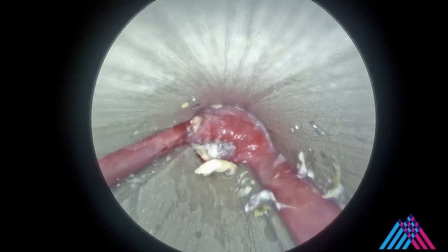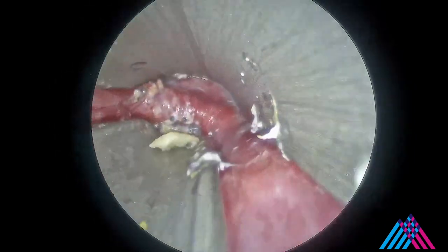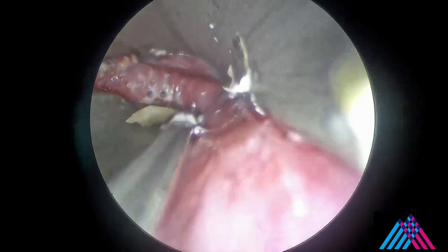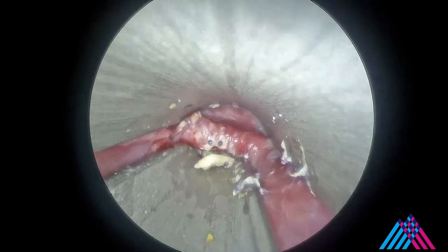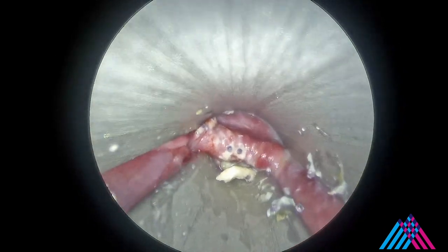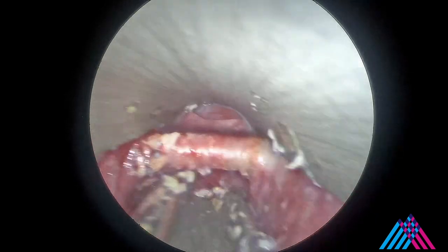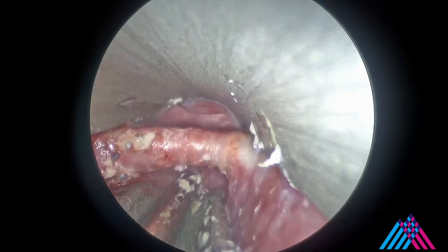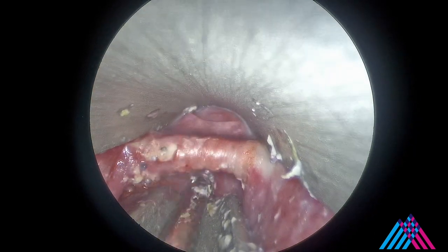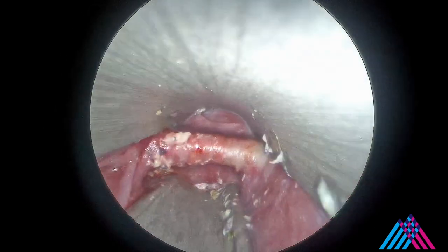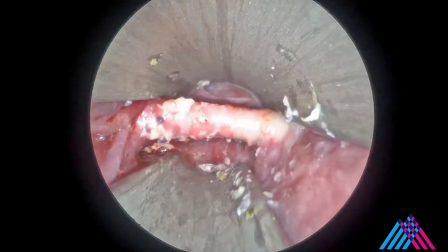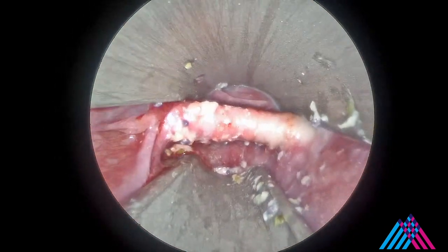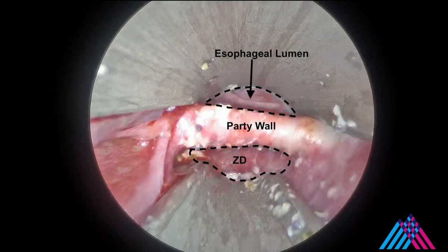Slowly, the party wall comes into view. The thick party wall separates the esophageal lumen from the diverticulum and will be stapled.